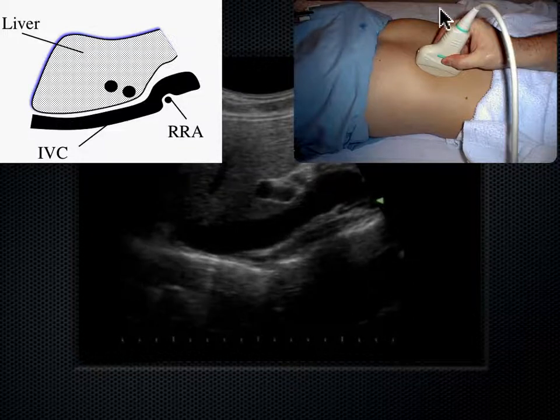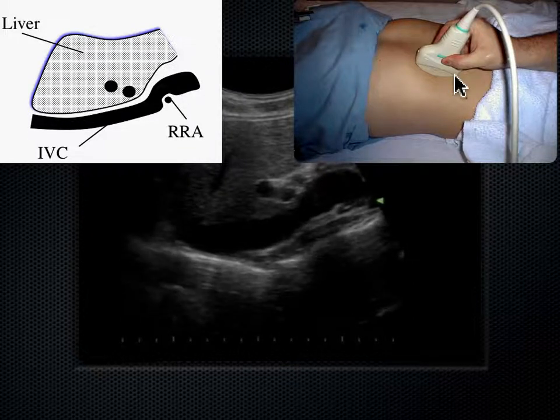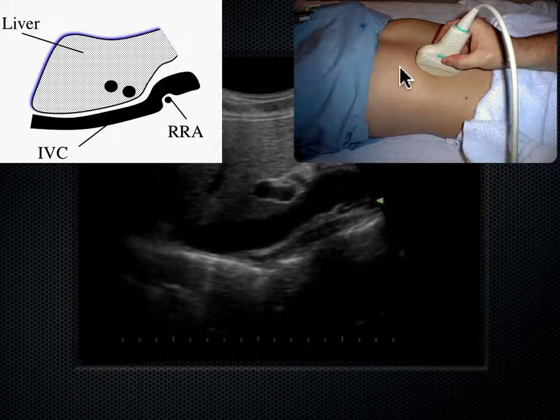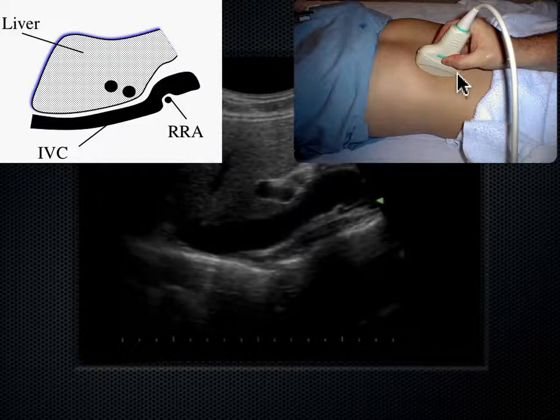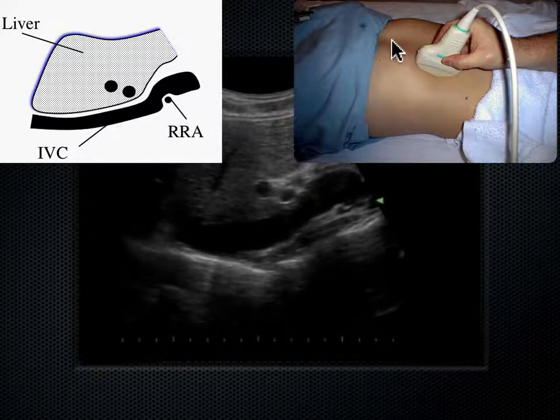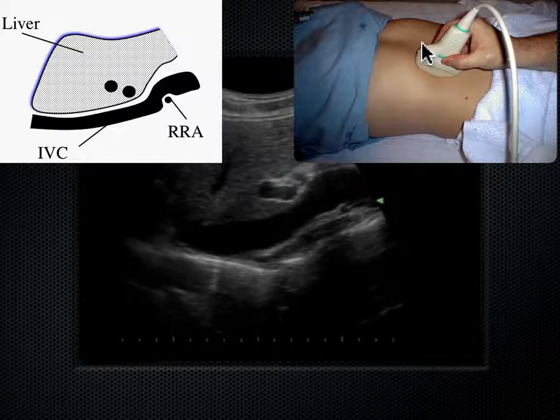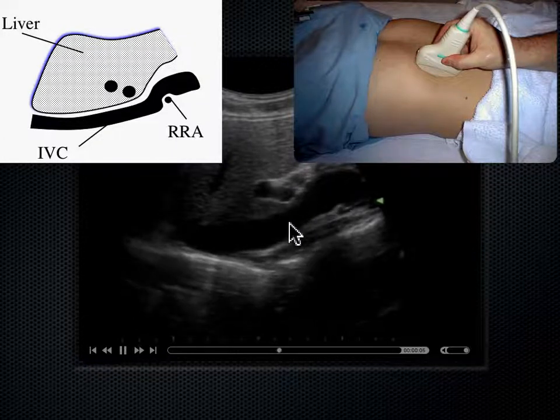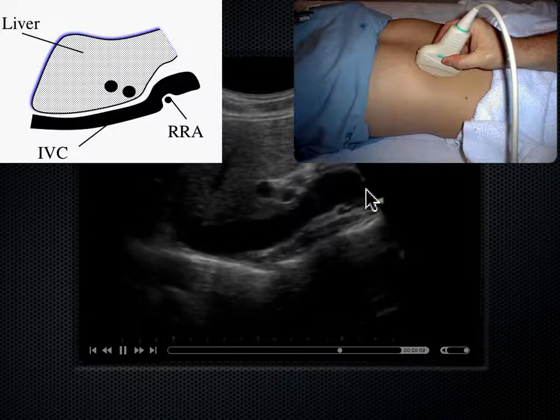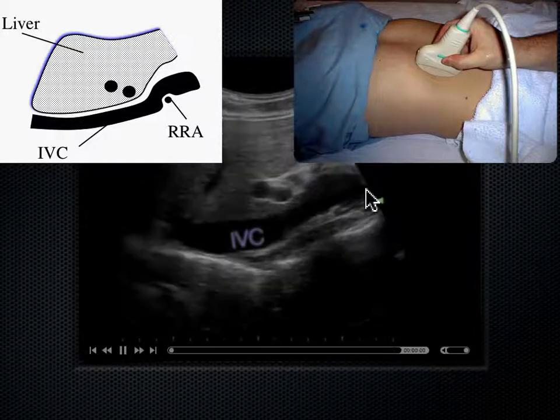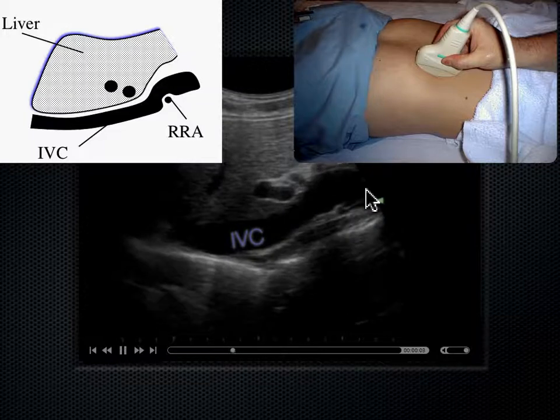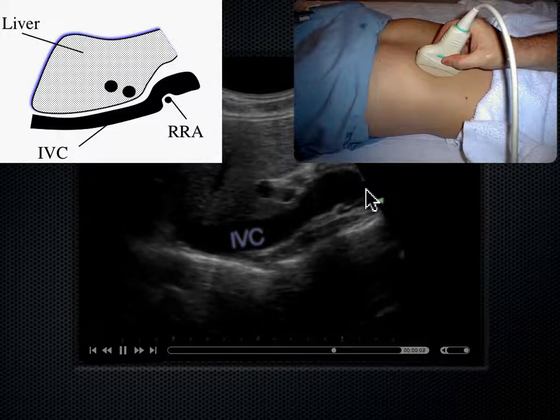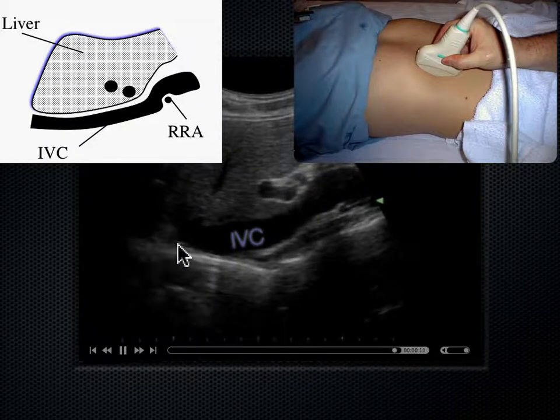The probe here is in a parasagittal right axis — 'para' means next to, and sagittal means a longitudinal anterior approach. Coming just to the right of midline, we see a vessel coursing underneath the liver — that's the IVC. The IVC runs up the right side of the body, the same way the aorta runs down the left side of the spine, bringing blood back towards the heart.